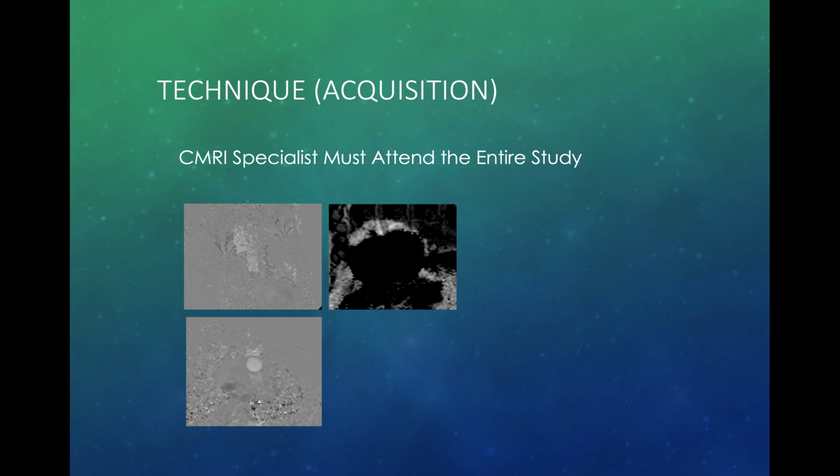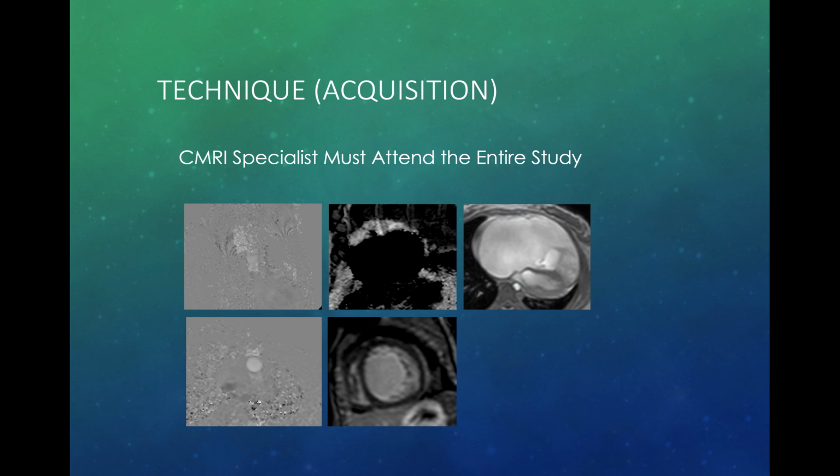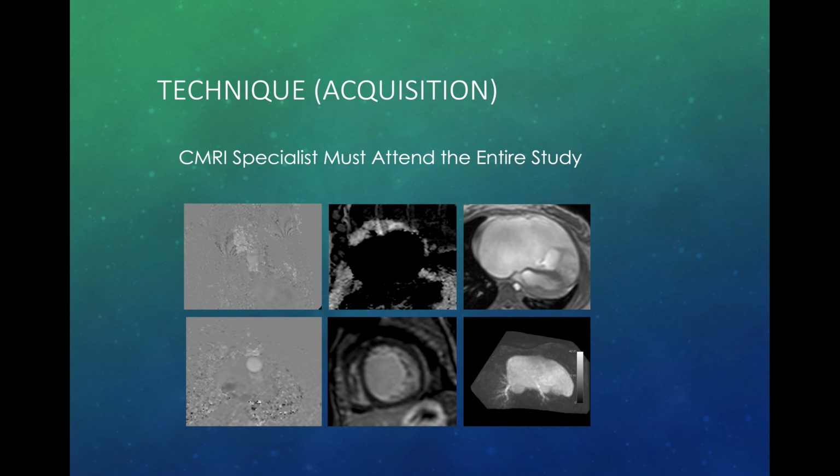Another example is the nulling point of delayed gadolinium enhancement. As you may see, the nulling was very bad. This is another example, in a patient with Ebstein's anomaly. The clinical question was about the tricuspid regurgitation and the RV volumes. But the radiographer was alone, so he injected the patient with contrast, which was unnecessary in this case.